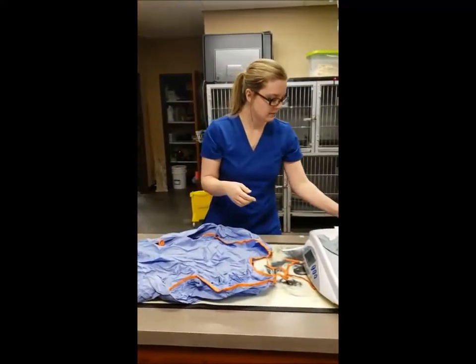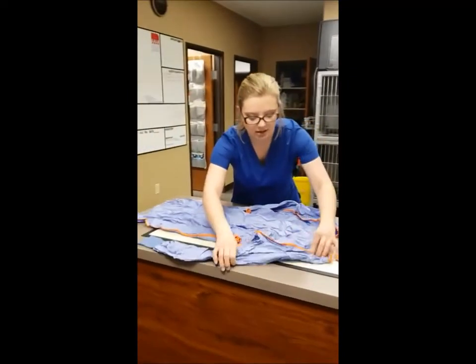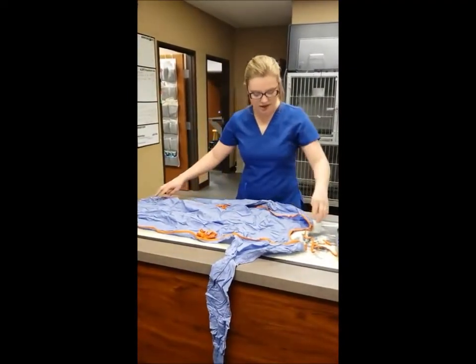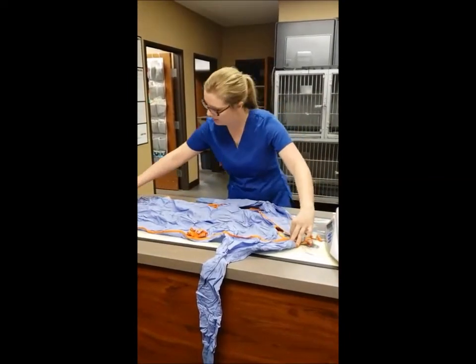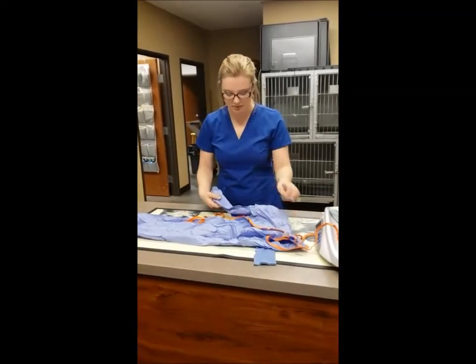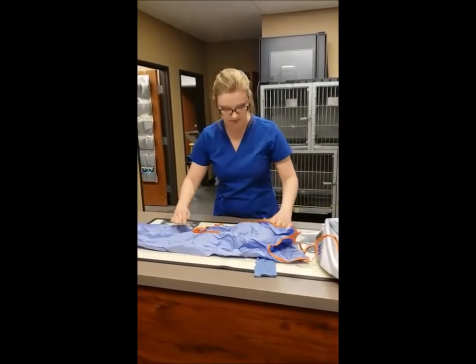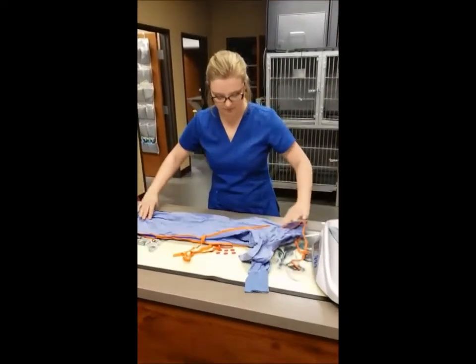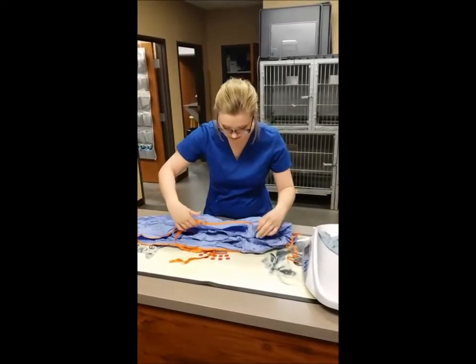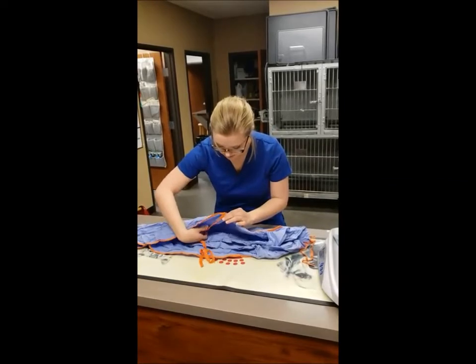Okay. So first thing, first lay this out this way. Get it straight here. And so I'm going to take the top right here. I'm going to fold this in half this way, set it right here. I'm going to put the sleeves on the inside, flip it over. I'm going to put the sleeves on the inside here so that they're not touching anything on the outside. Put this in here as well.